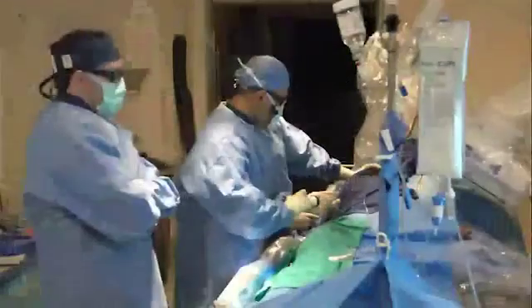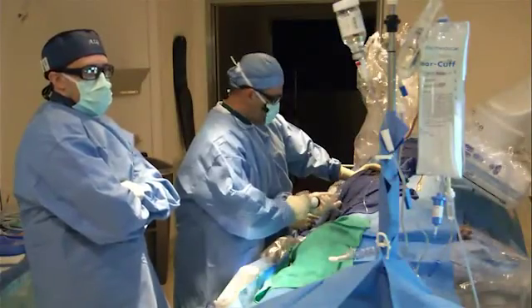Sure. And we can discuss, but we're going to do a DCB of the proximal SFA, and then we reassess the situation. I think that if you recall the angiogram, it didn't look that bad. I think it may be amenable. So I'm just going to overlap the Viabahn with the DCB and place 2 DCBs in the proximal SFA and take care of the proximal SFA with the 2 DCBs like that.